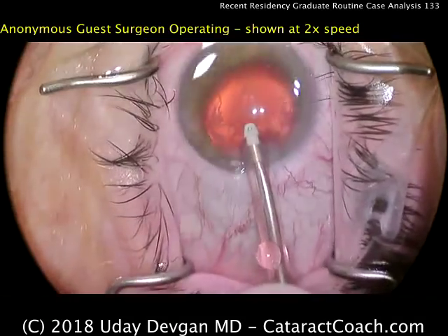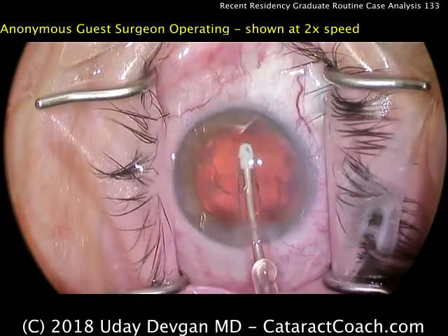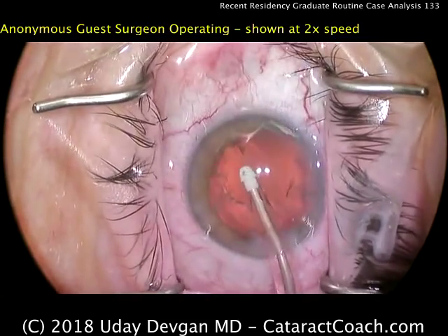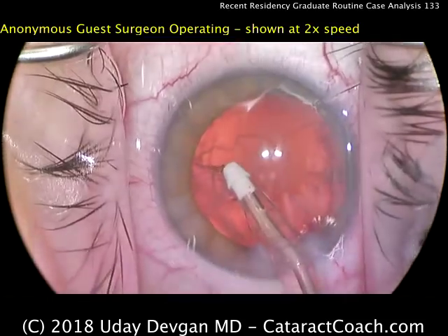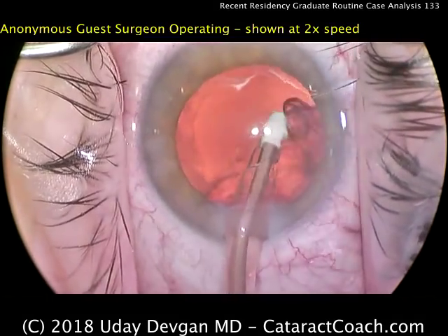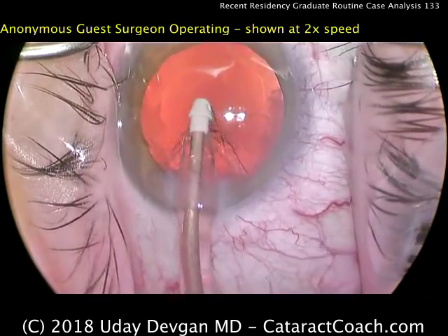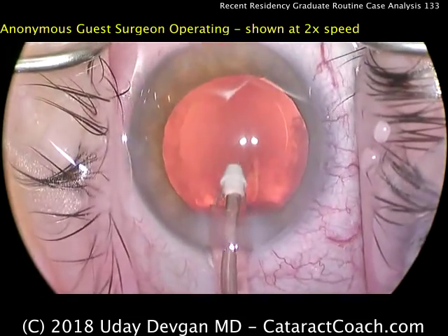Here's the IA probe going in the eye, using the polymer tip, and removal of the cortex material. Again, looks pretty good — nice and controlled. I do like this circumferential technique; that's my technique as well. I tend to grab a few more clock hours of material first, but done beautifully.